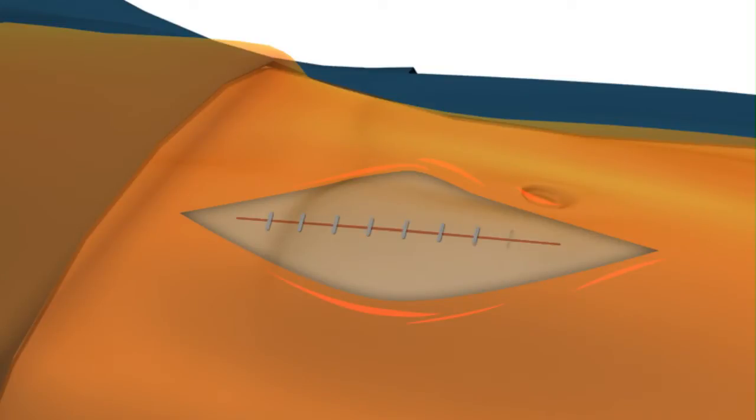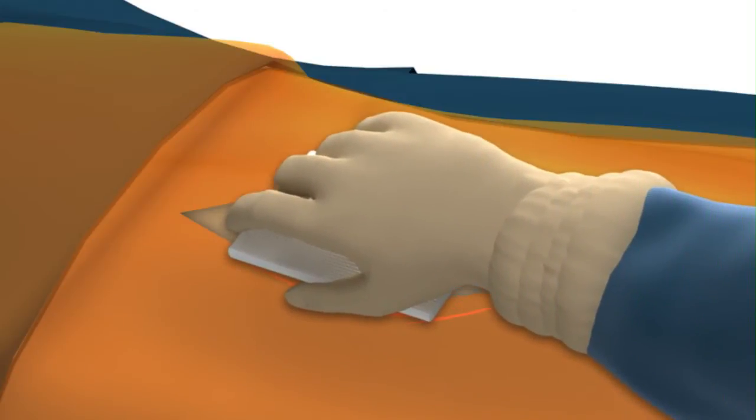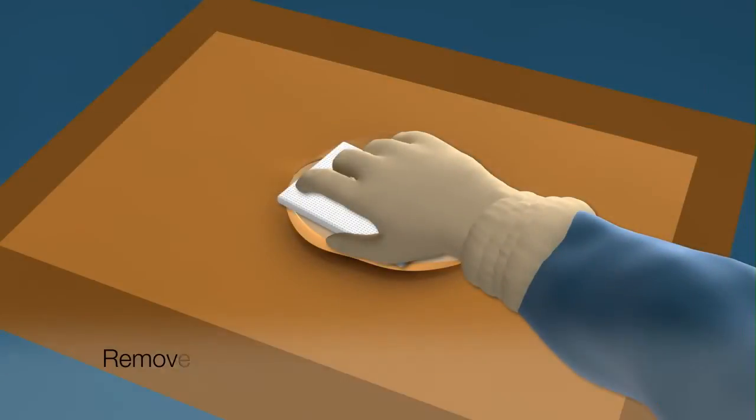After skin closure, cover the incision with the wound dressing. To remove the 3M Ioban II incise drape, fold the drape with attached linens, if used, back on itself at a 180 degree angle.